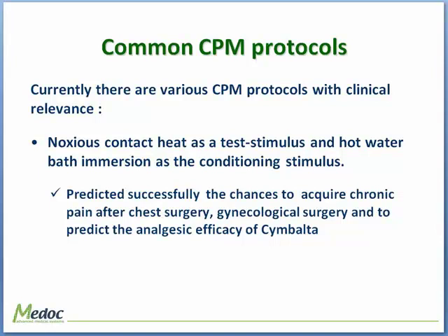We will talk now about some common CPM protocols that are used around the world. There's a large variability, so we will explain some of the most common, and we will see later that standardizing one protocol would be very difficult. Since we're talking about the pain-inhibits-pain phenomenon, we need two noxious stimuli. And they have to be painful.